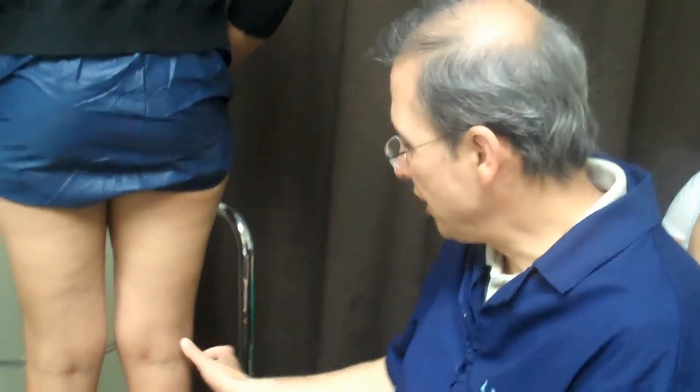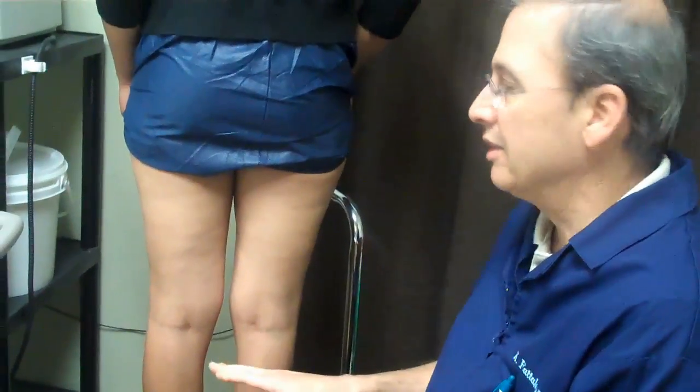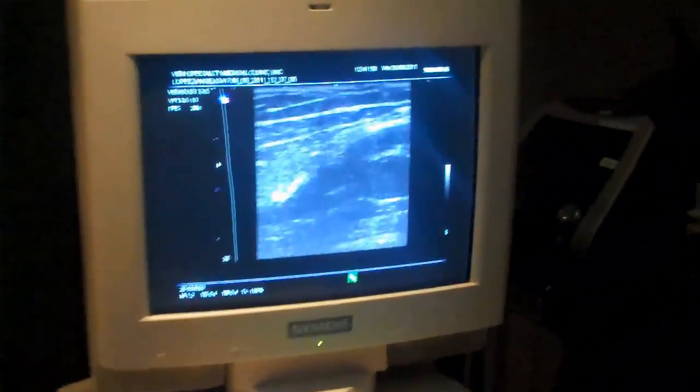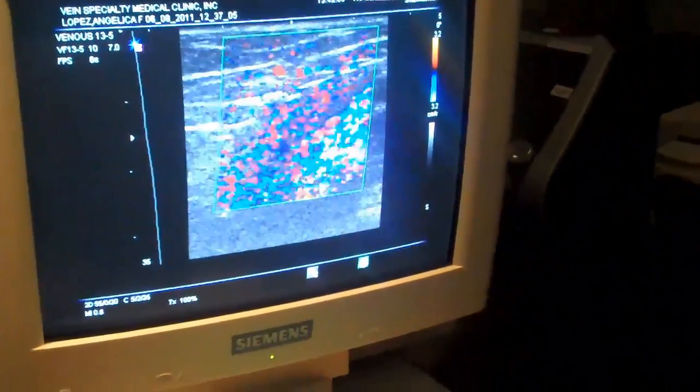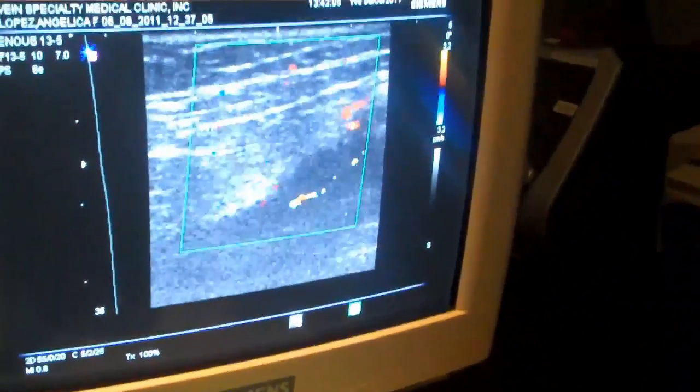Let me show you: this young lady has had three pregnancies and she has pain — a little bulgy vein — and pain along the lateral and posterior right calf with standing. The pain is relieved when she lays down. So we're going to check with ultrasound and see what we find.